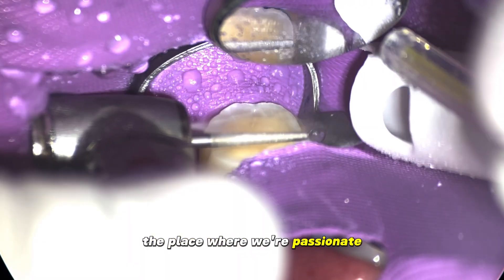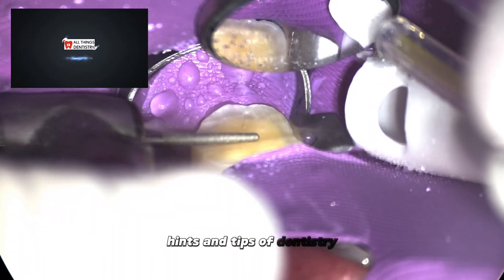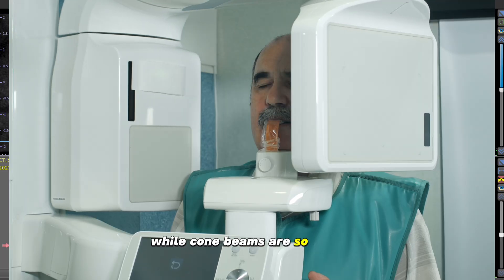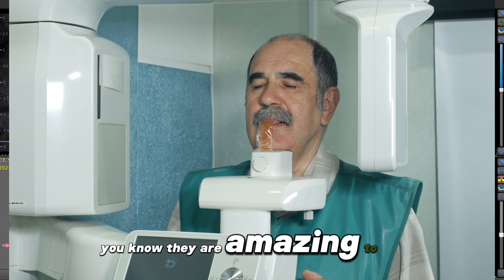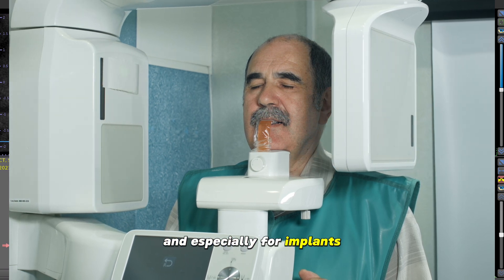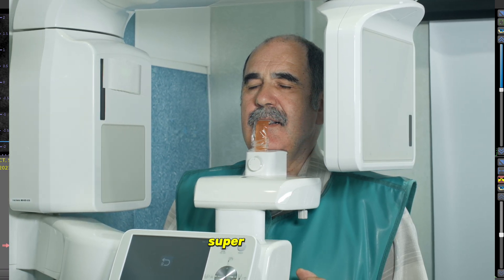Hey, this is Ash from All Things Dentistry, the place where we're passionate about sharing those unwritten hints and tips of dentistry. Cone beams are so useful — I know you know they are amazing to use, especially for implants, but especially for endo. Super helpful.